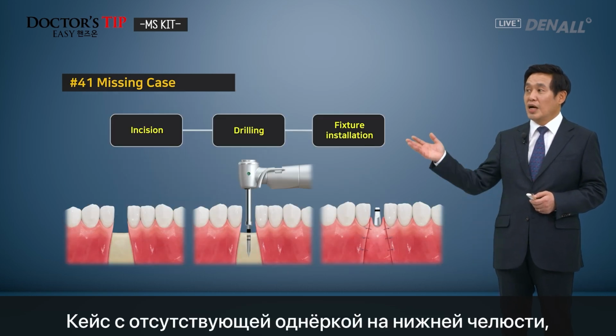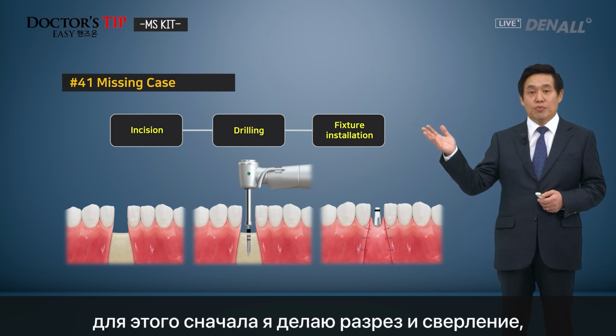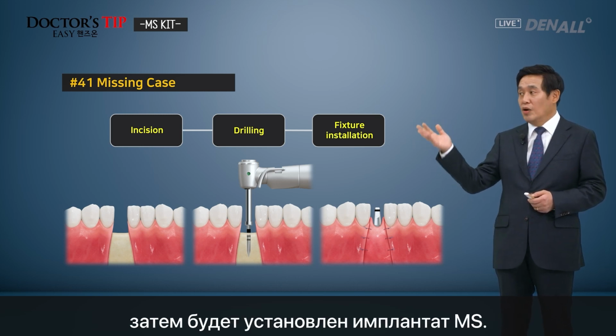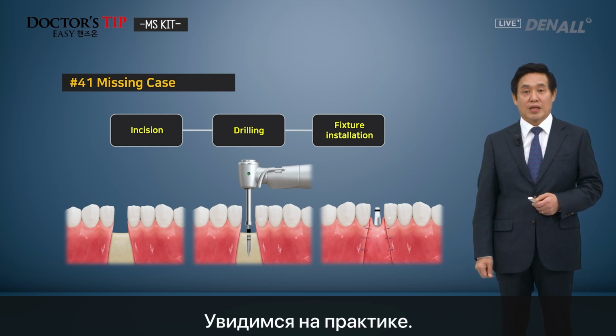So this is the case. 41 is missing. For that case, first I do the incision and drill, and then the MS fixture will be installed. I will see you in hands-on practice.